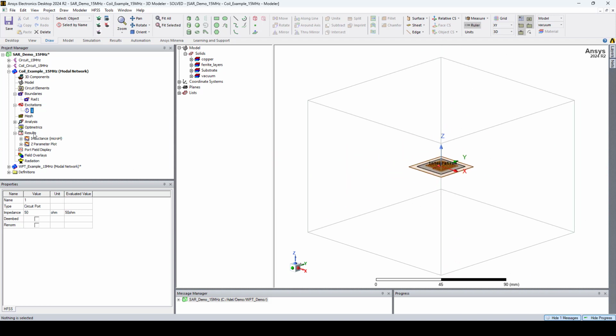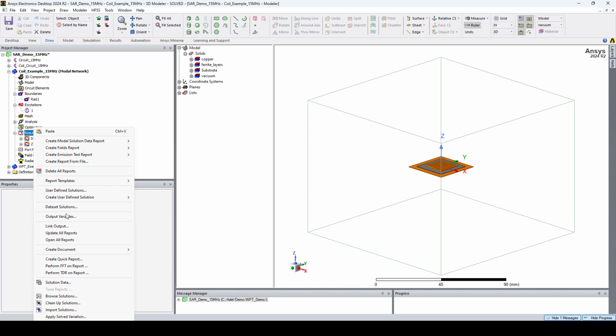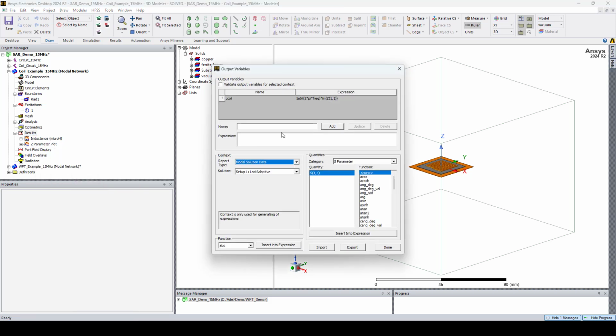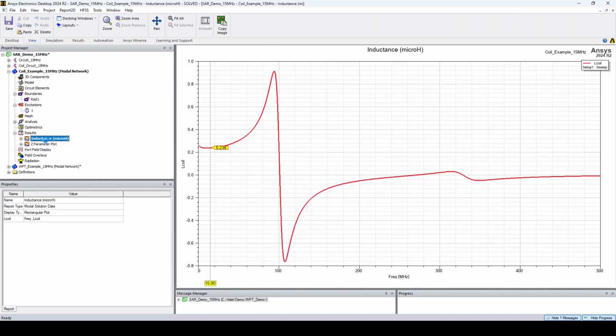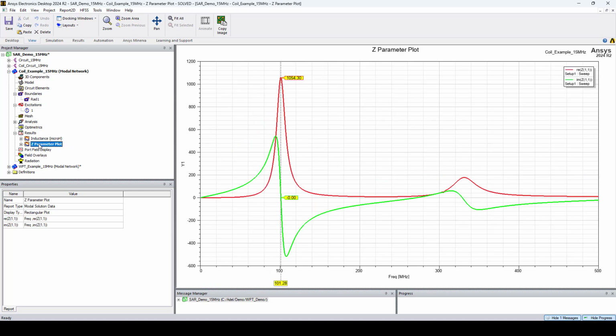Now, if I go to results and right click, we can select output variables and create a new output variable. Here I added the expression for the inductance in microhenries to plot it. Here we have the inductance plot, and we have an inductance of 0.238 microhenries at 15 MHz. We can also plot the coil self-resonance, which is shown here. You can see that the coil's self-resonance is around 100 MHz, which is higher than the desired operating frequency.